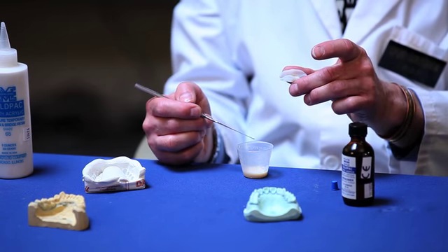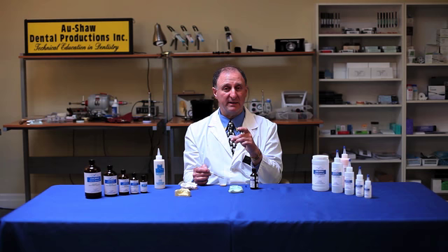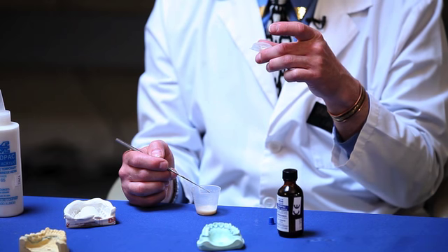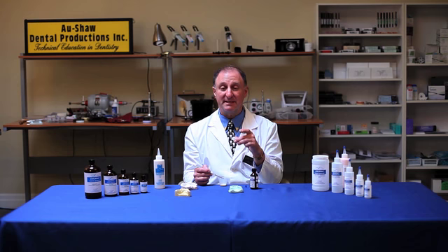Once it's sufficiently thick, it's then applied into the mouth again for the patient or onto the model. And once it reaches a dough stage of approximately 2.5 minutes, it's then removed from the mouth or the model and then left to set. We can trim away all the excess material and then polish it. The nice thing about the material, it polishes to a nice high luster.